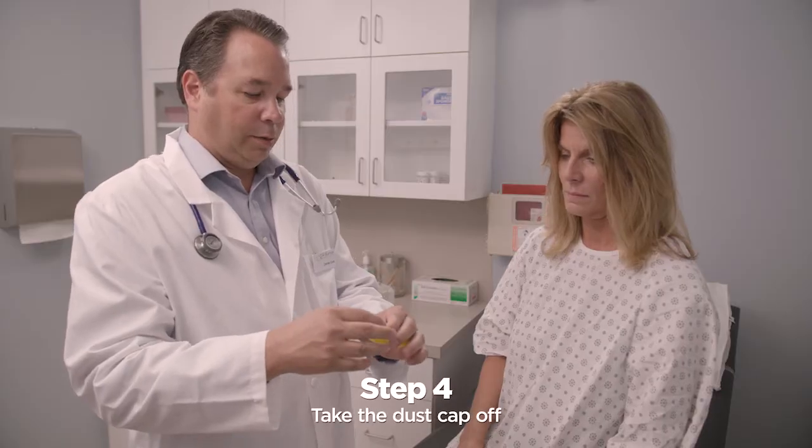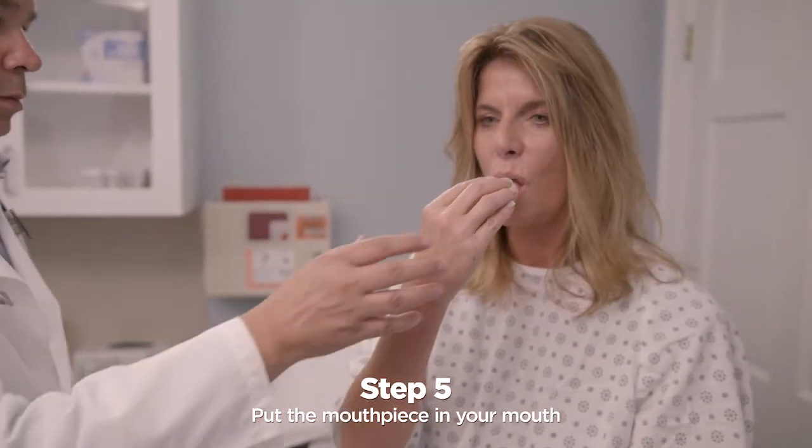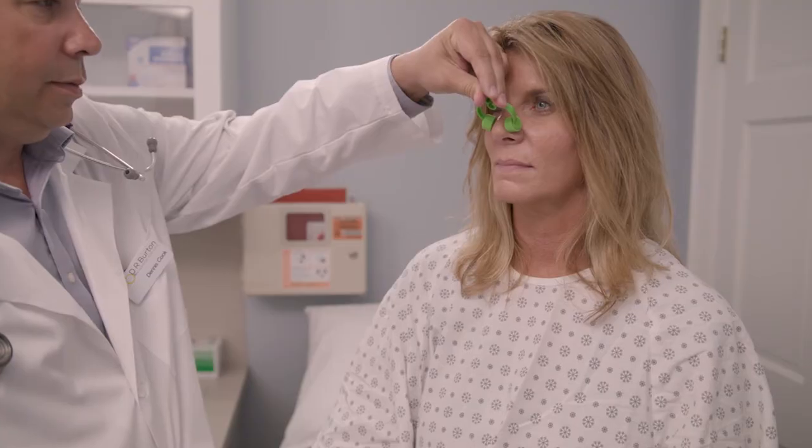Take the dust cap off the Pocket PEP. Put the mouthpiece in your mouth and close your lips around it to make a good seal. Make sure your hand does not cover the holes near the bottom. Your healthcare practitioner may tell you to use a nose clip, if needed.